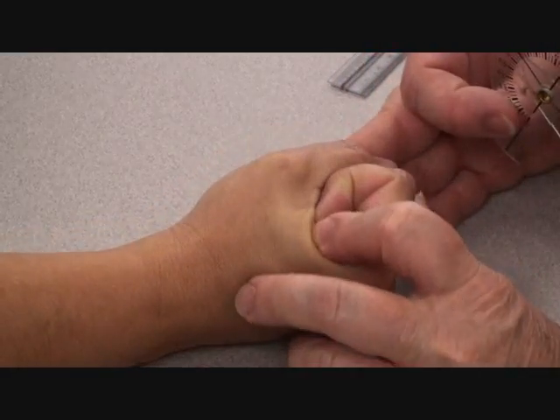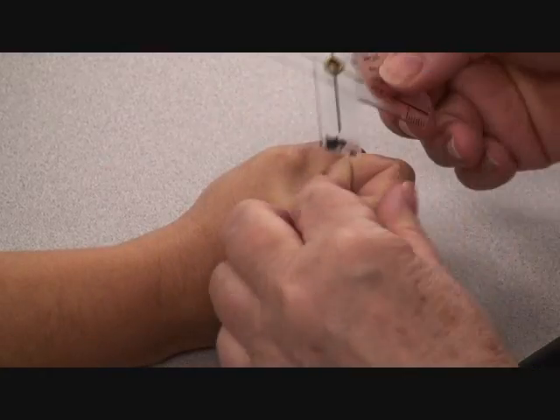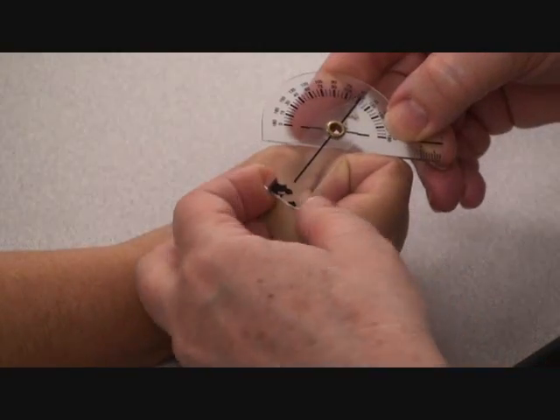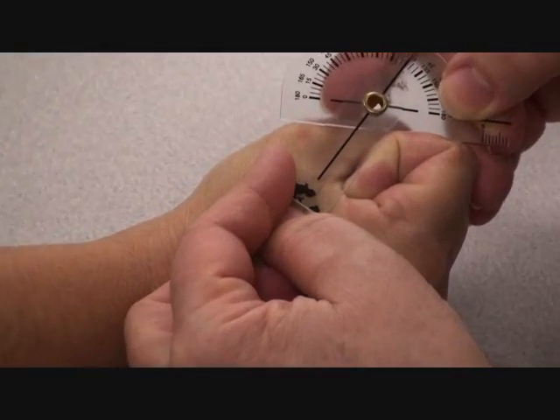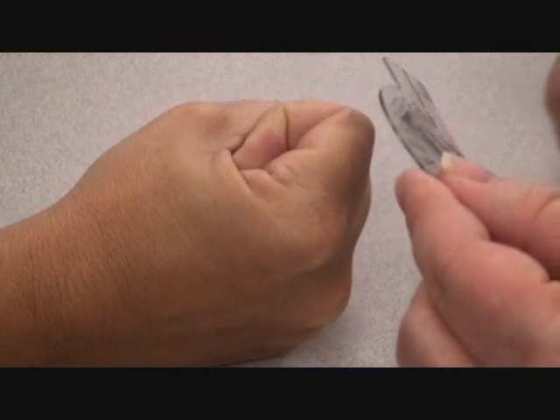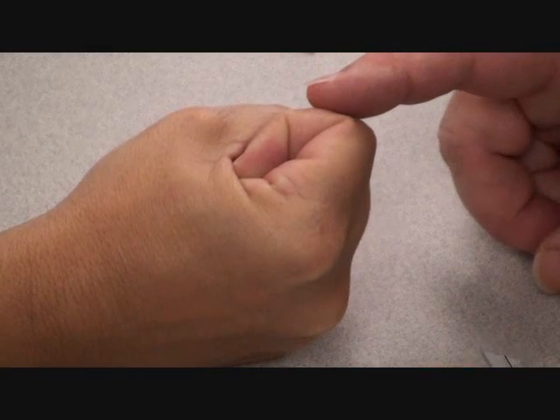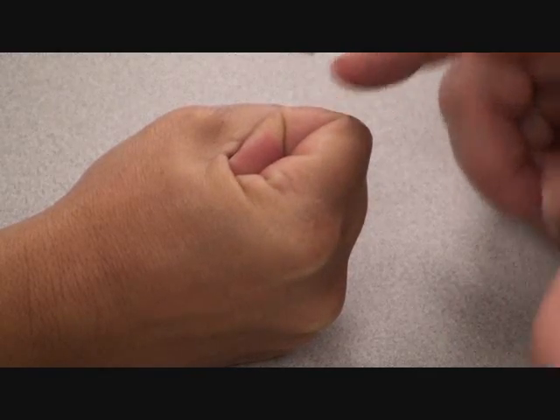And then in the case of the DP on the index finger, for her, I could still pretty much go over the top. Just try not to pinch that skin from her web space, but I could still go over the top. Some people can't get their thumb out of the way quite that well. So more or less than 90 at the DP? Less. So I got 60.